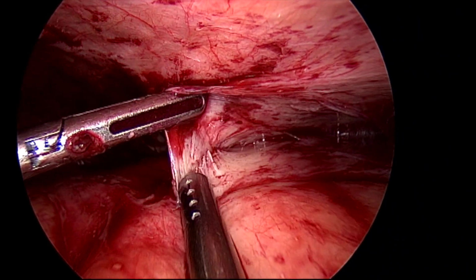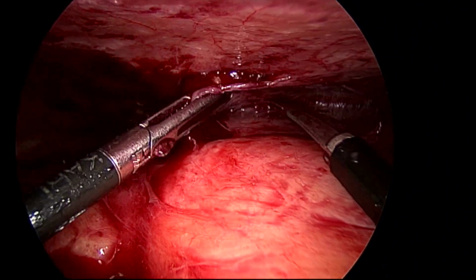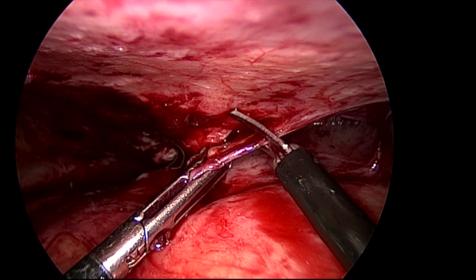So that can be divided. It's organized tissue, so I'm dividing that one. It's a thickened peritoneum only.